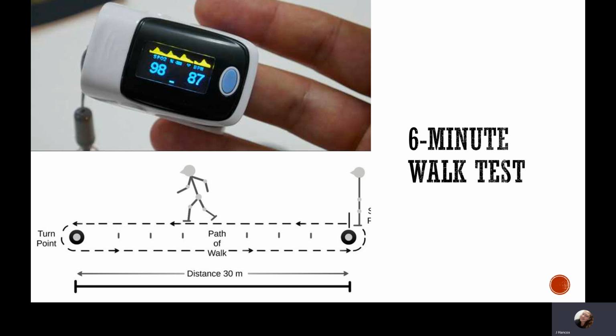This is also a good way to see if patients desaturate during exercise. So we do need to keep an eye on the pulse oximeter, because it has happened before that we need to stop testing because a patient's saturation has dropped below 80. And it is very important that we are very vigilant during this test, because accidents can happen. So that will normally be used as surgery screening. This and spirometry is normally used for screening for surgery.